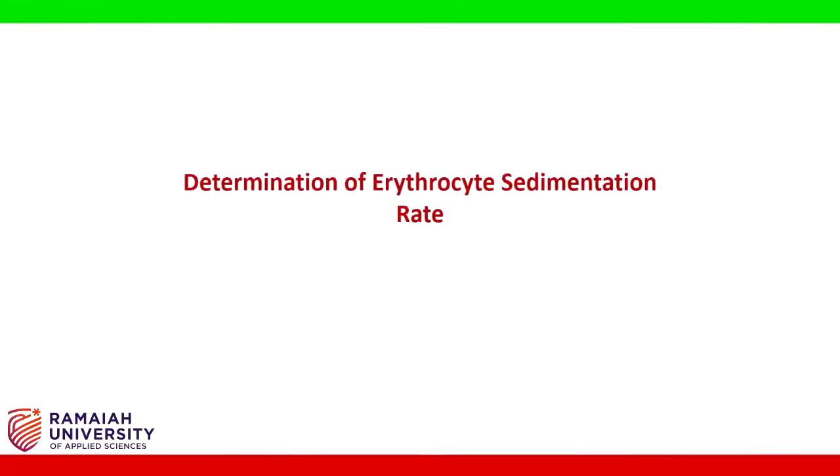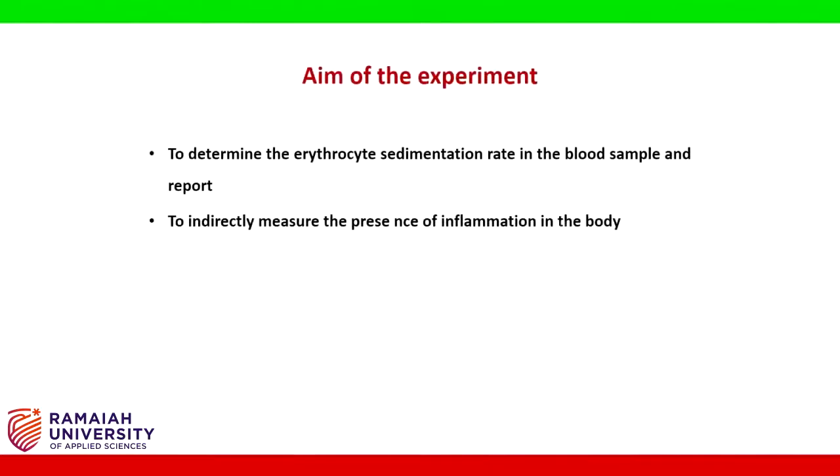Determination of erythrocyte sedimentation rate. Aim of the experiment: to determine the erythrocyte sedimentation rate in the blood sample and to indirectly measure the presence of inflammation in the body.